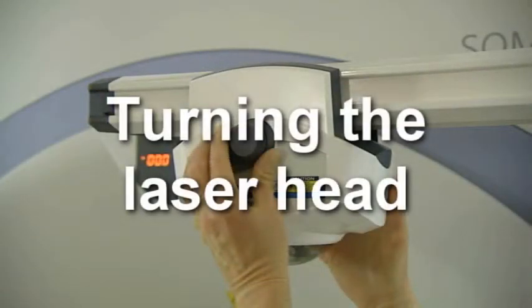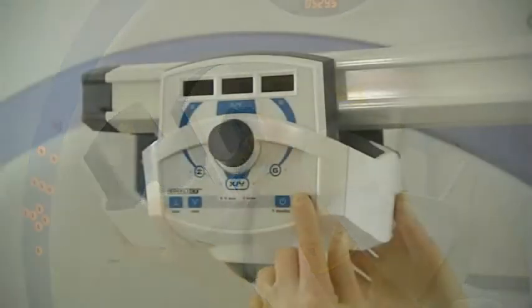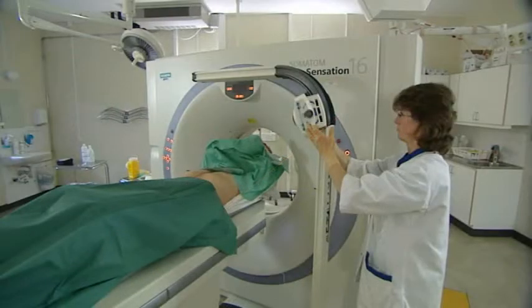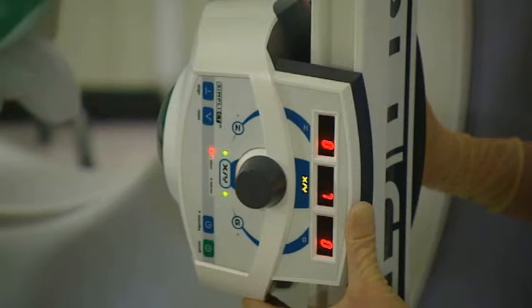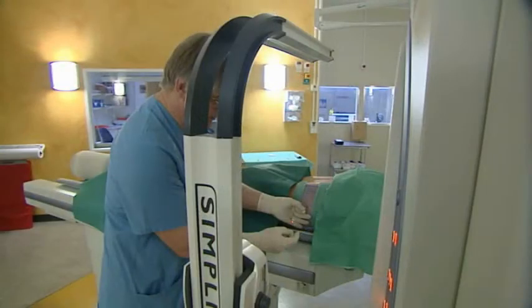If the display is towards the gantry, simply turn the laser unit around so that the display faces out. Make sure to align the unit with the edge of the table before releasing the brake handle and move the laser unit down the vertical rail. Keep the laser at the hub of the needle when advancing the needle towards the target.